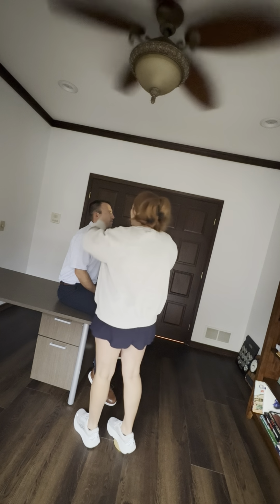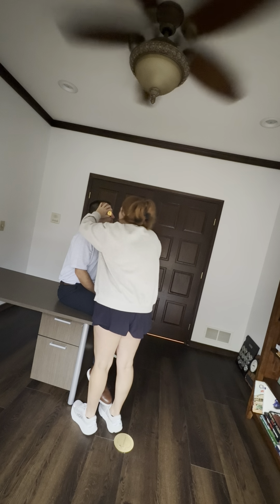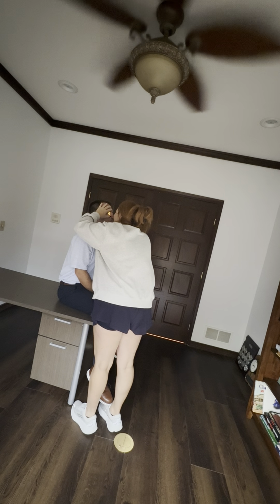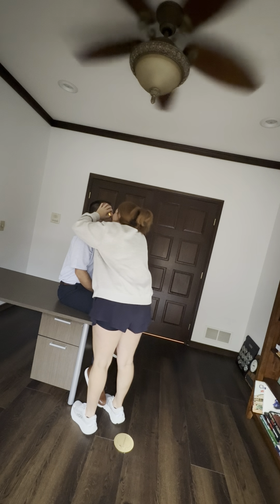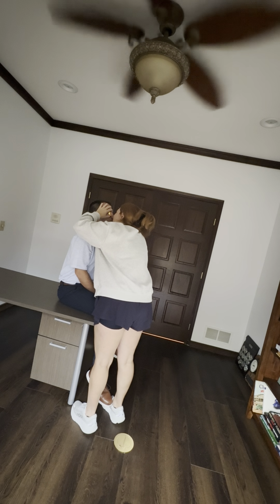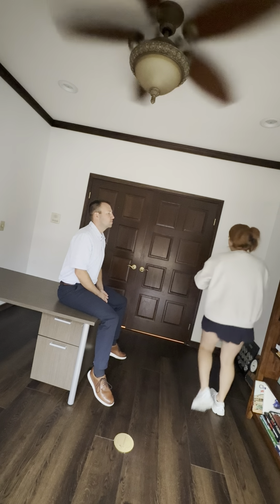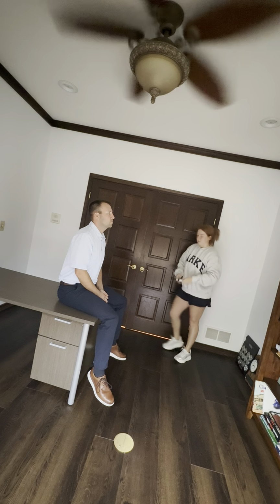You're going to feel me put my hand on your head just to kind of steady myself, and I'm going to get real close here. Just keep looking at that spot. And I'm going to use my diopter to adjust as I get closer. Okay, very good. So I can see your optic disc. It looks good. There's no papilledema. I can see the veins and the arteries, and I'm going to switch for the other side.